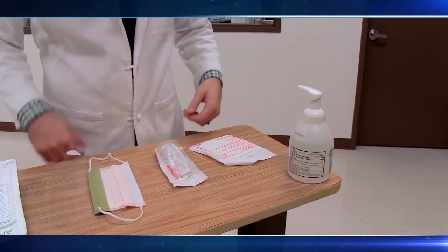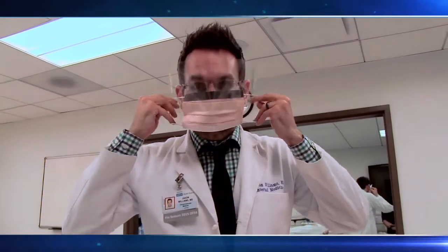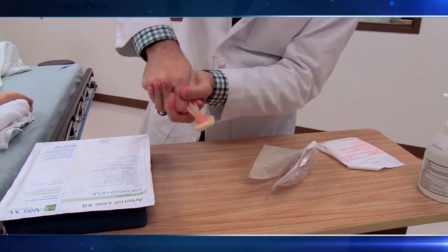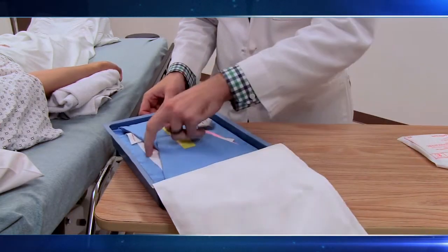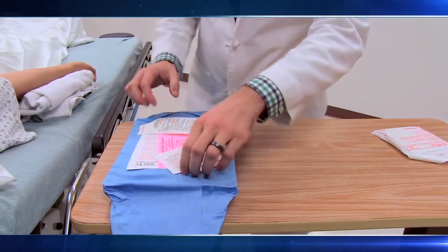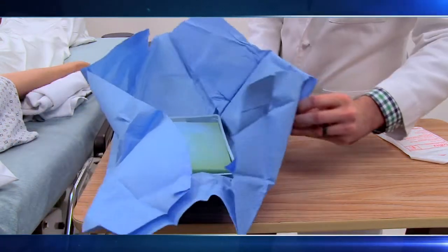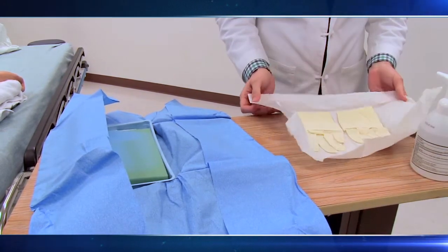The CDC recommends a minimum of hand sanitizer, face mask, chlorhexidine skin prep, then open the kit in a sterile fashion, then place your sterile gloves, as well as a sterile drape.